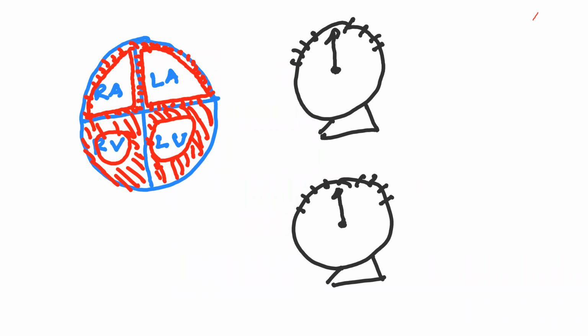We can manually change the negative or positive electrode of the galvanometer, but we are unable to change the electric activity of the heart.